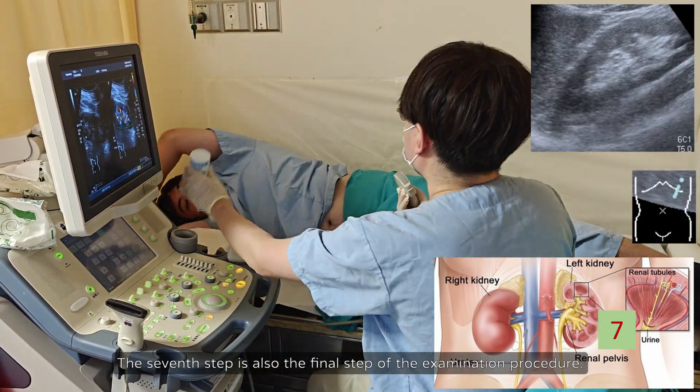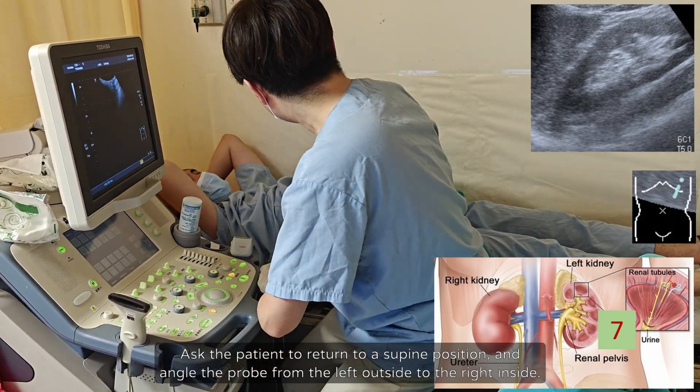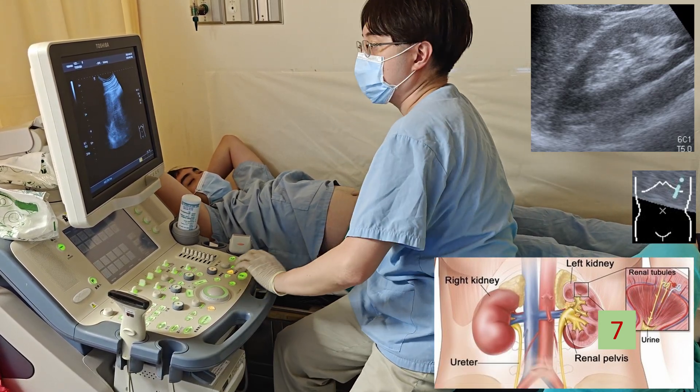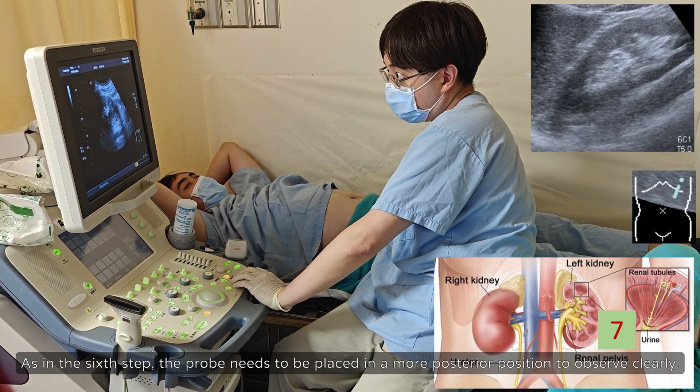The seventh step is also the final step of the examination procedure. Ask the patient to return to a supine position, and angle the probe from the left outside to the right inside. As in the sixth step, the probe needs to be placed in a more posterior position to observe clearly.